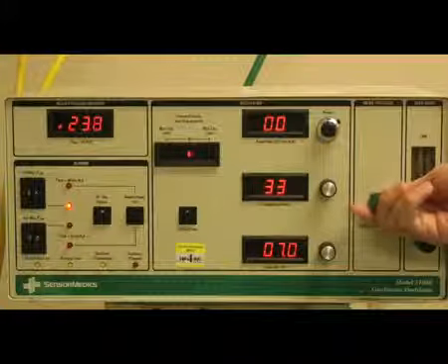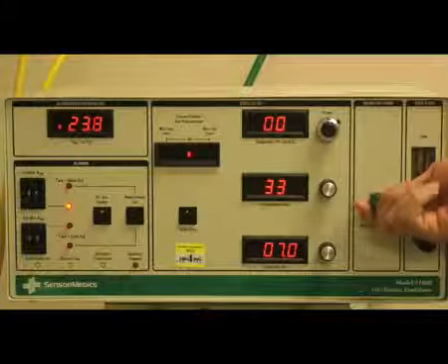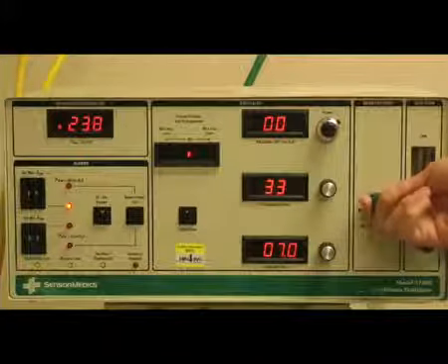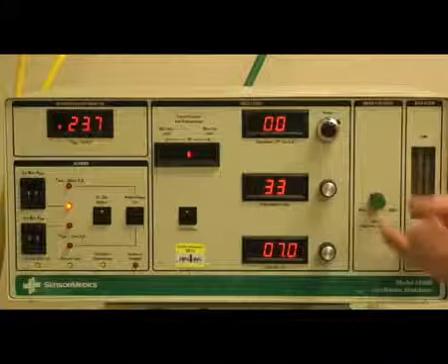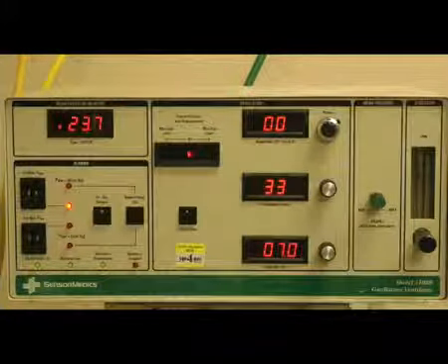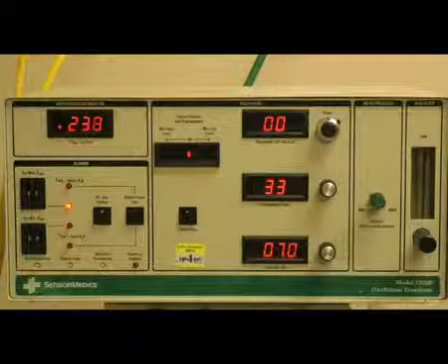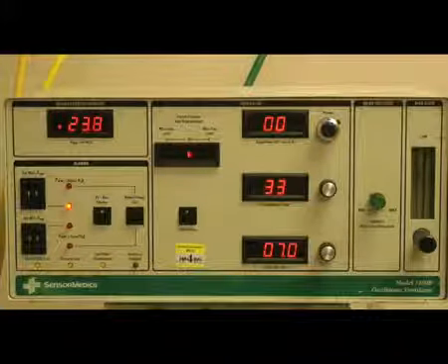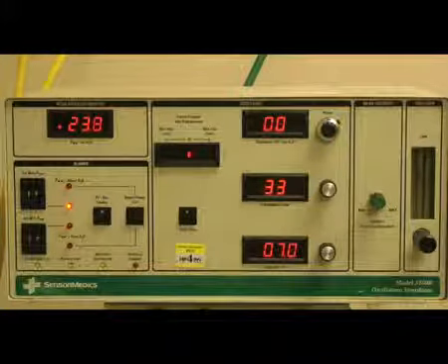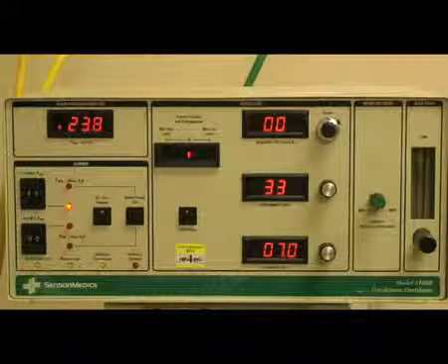If your oxygenation is greater than your goal range, you can decrease your FiO2 by 5% every 5 minutes until your SpO2 is between 88 and 95%. Once your recruitment maneuver has been completed and you've returned your patient to your initial settings, you will need to observe the patient for 4 hours and increase the FiO2 as necessary during this period if your oxygenation is less than your goal range, persisting for greater than 5 minutes.